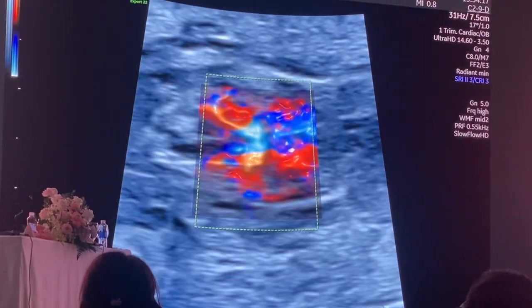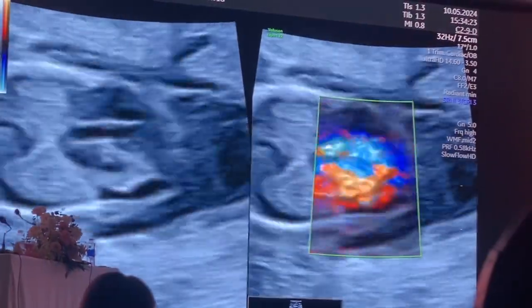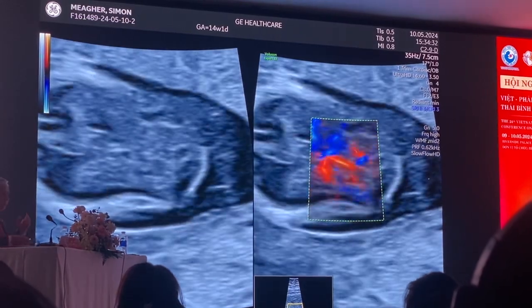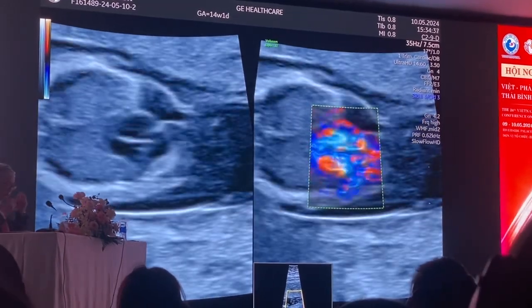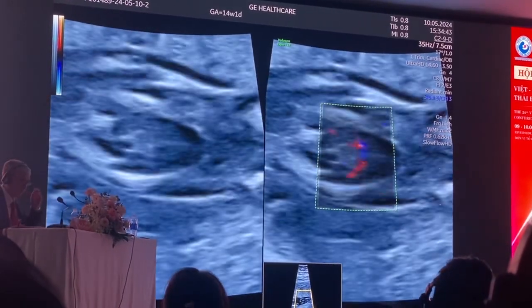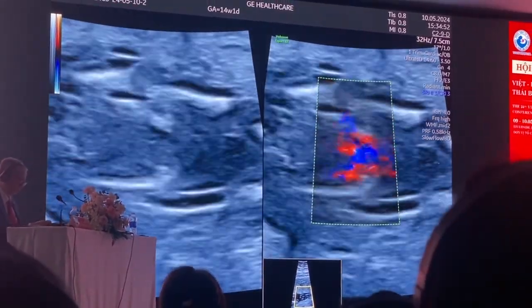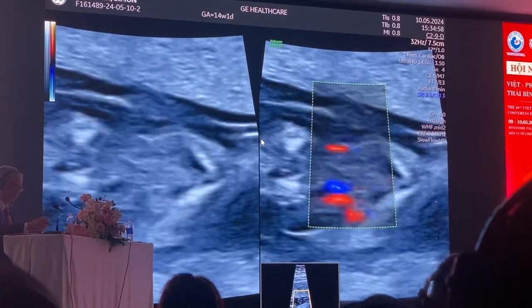So my next step is I want to look with slow flow technologies. So I split my screen into a 2D and 2DC. And for this, to look at the ventricles, I want to see the fill of the ventricles. So for this, I'm going to start by pulling back on the acoustic output and also pulling back on the color gain, and then see what the fill of the ventricles looks like. And then from there, come out to look at the subclavian. So I'm going to come up to look into the fetal arms. I'm going to increase my flow, and I see my subclavian artery coming into view just here. It's not aberrant, that's normal, because it's halfway from the chest into the spine. So there's no aberrant subclavian.